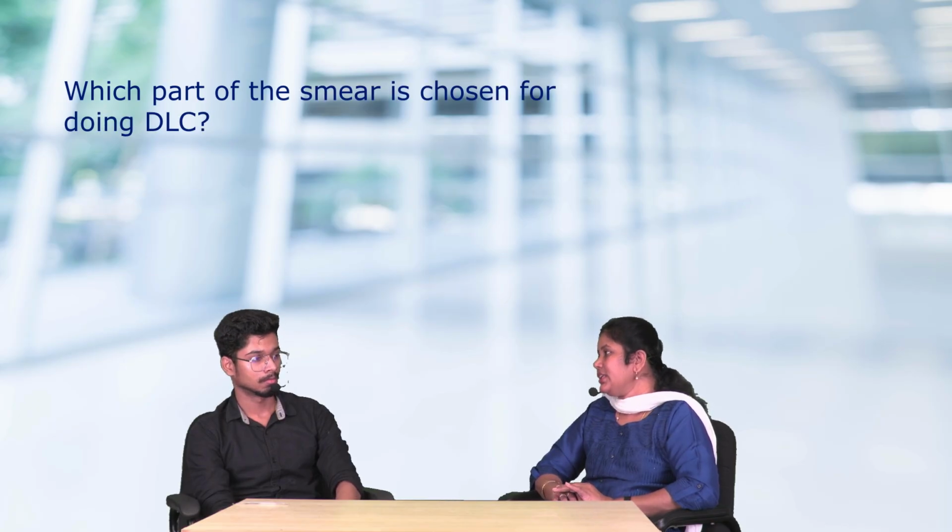Okay, fine. So you have added oil and you are just scanning through the peripheral stained smear, and you should go in a zigzag manner so that it covers most of the length of the smear. Now, which portion is ideal for counting the cells, I mean identification and counting both? It's the junction of the body and the tail, ma'am. You should move towards the tail part, not the head part. You should start from the junction of the body and the tail and move towards the tail part.